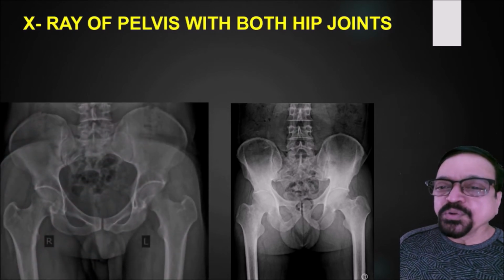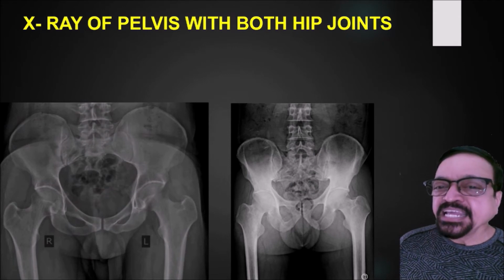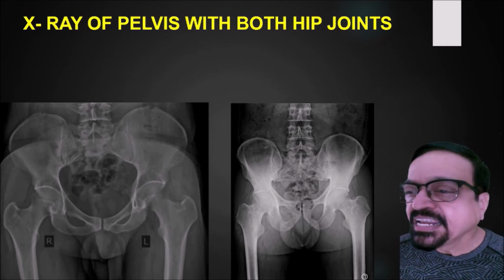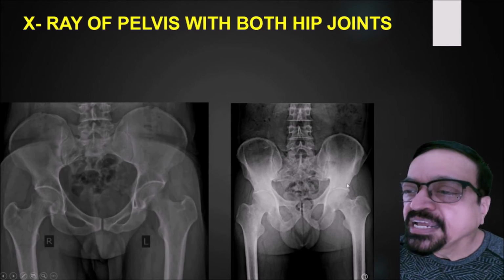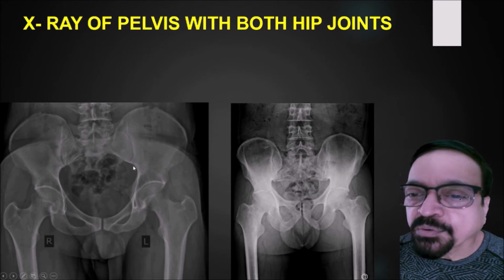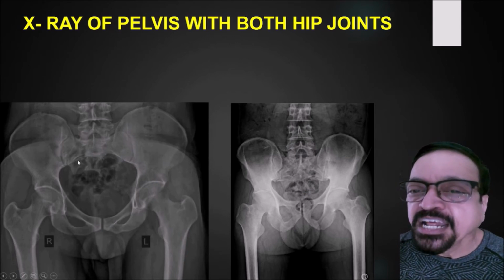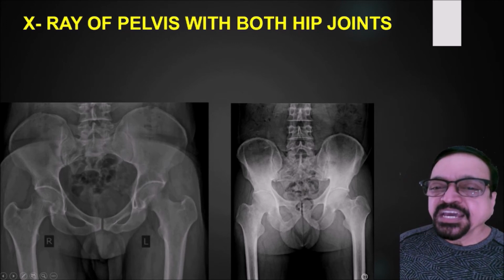We are showing you two radiographs, radiograph 1 and radiograph 2. What is the difference between these two is you can see the pelvis and iliac. If the angle is straight, you will see something like the left side image. See the pelvic outlet, and here you see the pelvic outlet. Of course, it differs between a male patient and a female patient, but by and large, if the angulation is changed, here we can know it.